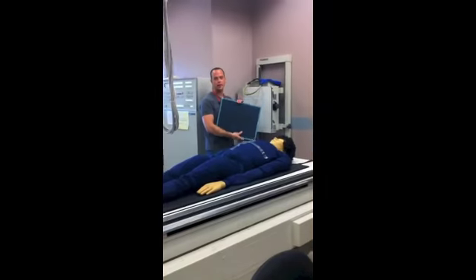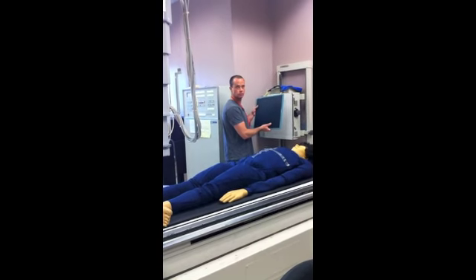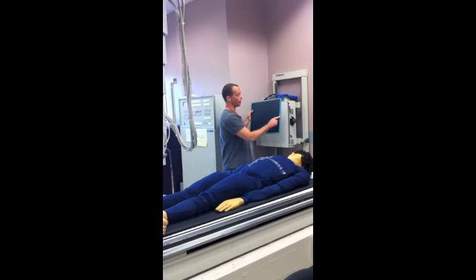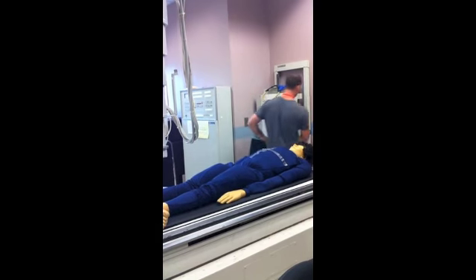We'll put in a 14 by 17 IR crosswise with the green marker on the patient's right-hand side.